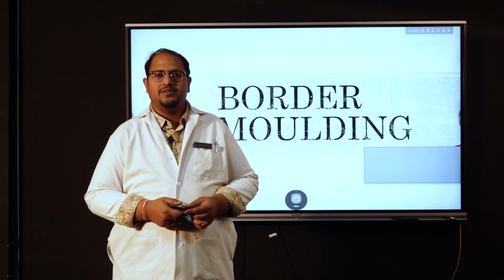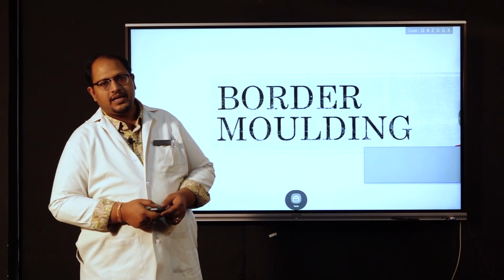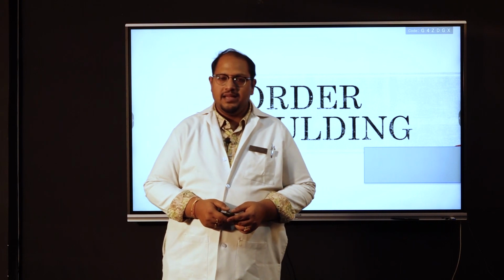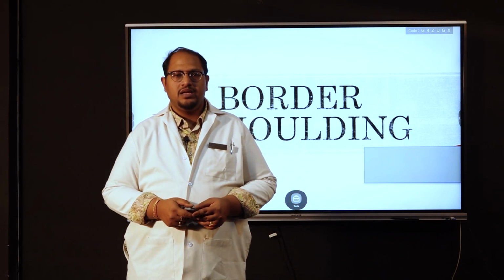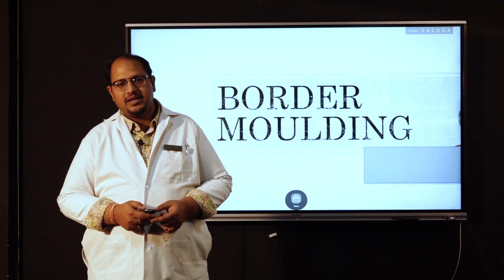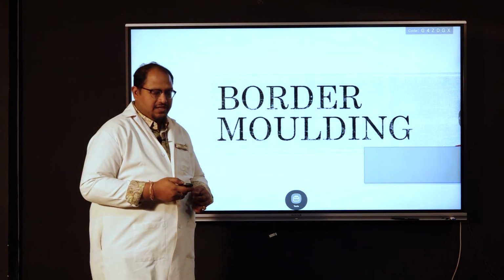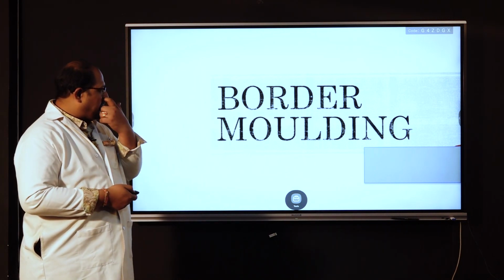So the topic for today is border molding, which is also commonly known as peripheral sealing, and which is to be done after the special tray, the custom tray for the patient, is made, right? So we will be seeing today what exactly is border molding.